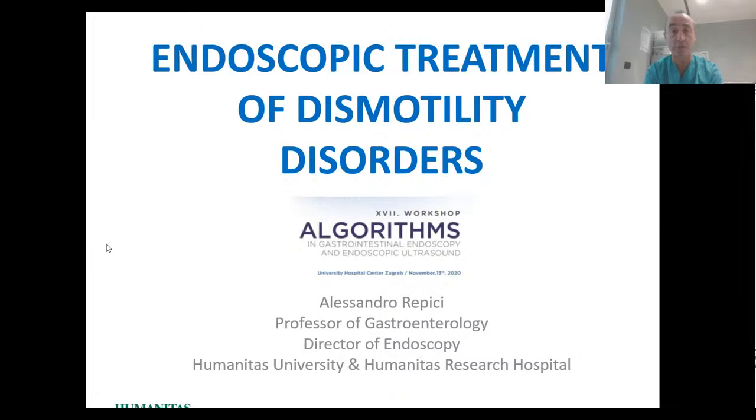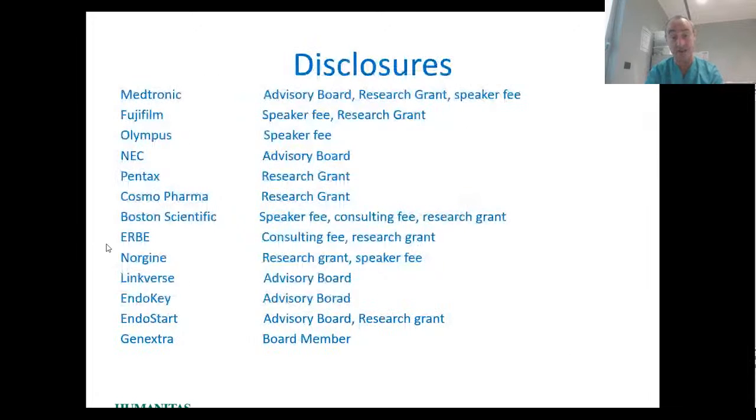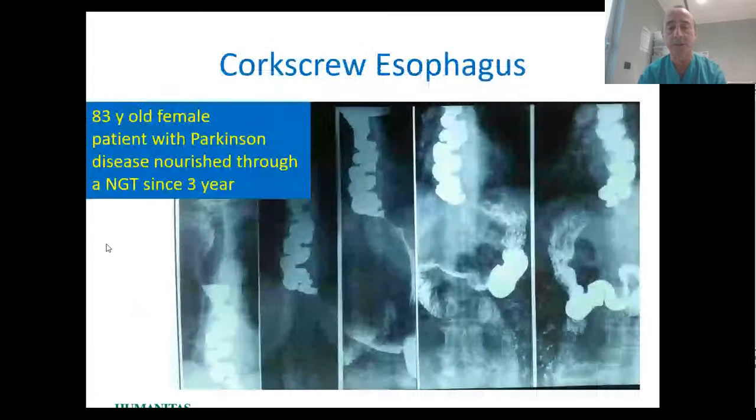And my task today is to talk about endoscopic treatment of these motility disorders. So these are my disclosures relevant to the topic of my presentation today. I want to start by showing a case I treated last month.